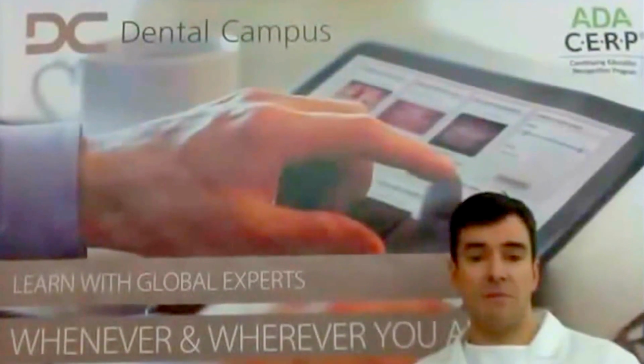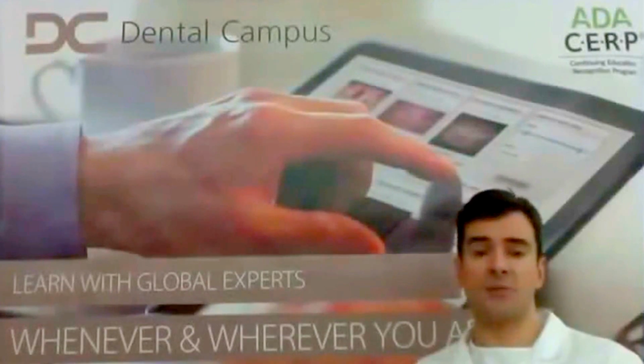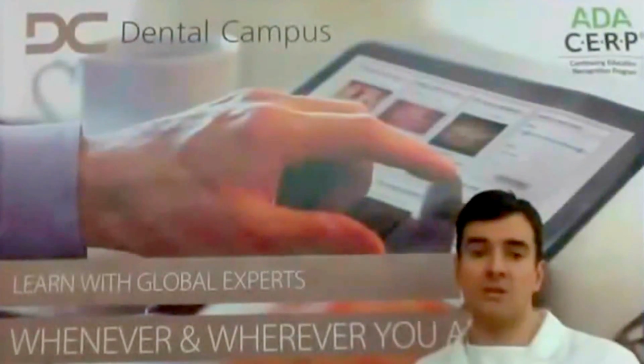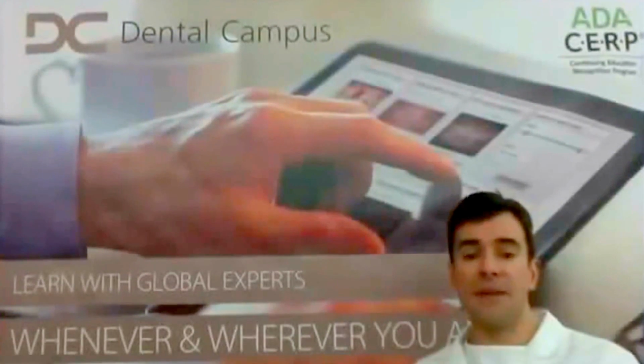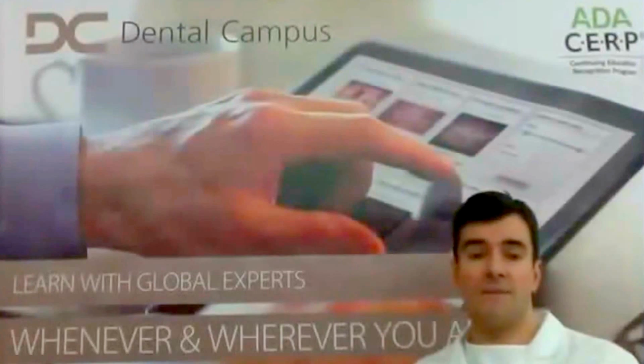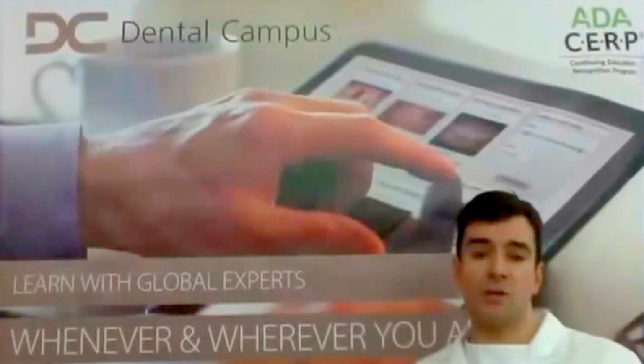So this is something also very predictable. Personally, I don't really like the aesthetics of this situation and also the hygiene. Or in some cases, in patients really desiring something fixed, we can use a provisional resin bonded adhesive bridge, so a Maryland bridge, which is bonded on both sides of the gap.